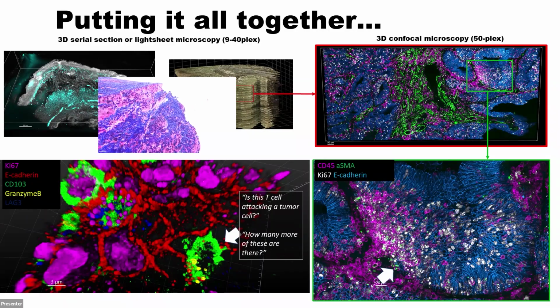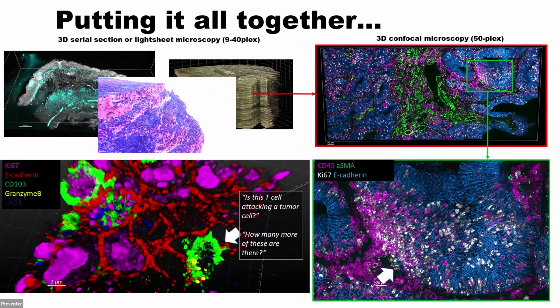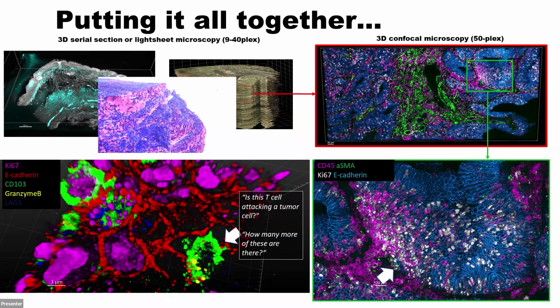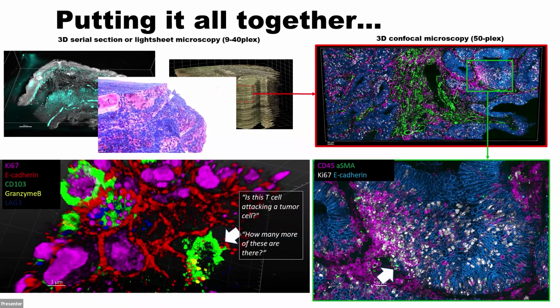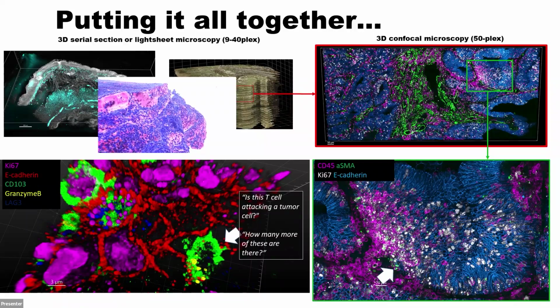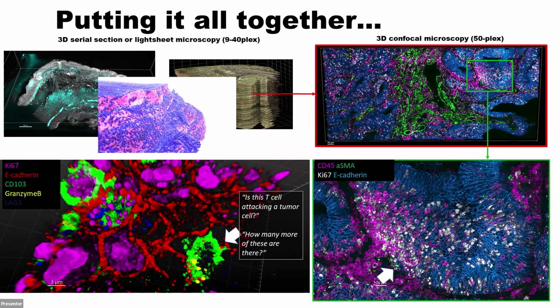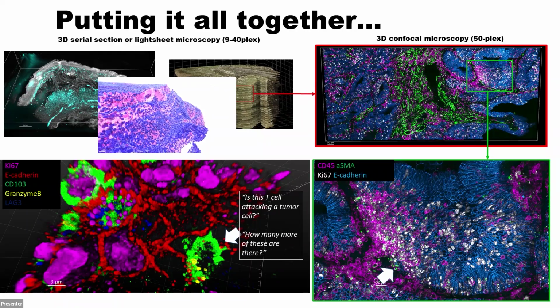This could be immune invasion into the tumor, or where the immune system is interacting with the tumor, but nothing's really happening yet. Once that area is identified, you can precisely section that region out and perform downstream high-resolution 2D or 3D imaging. This could be a more efficient way of using both resolutions, especially in an age where it costs money to store and analyze large datasets.